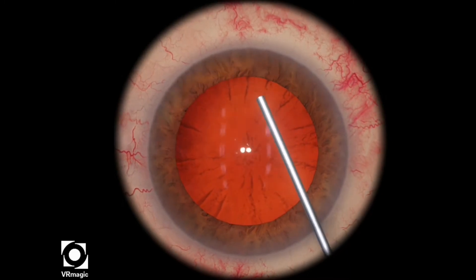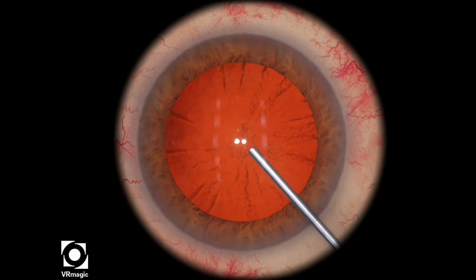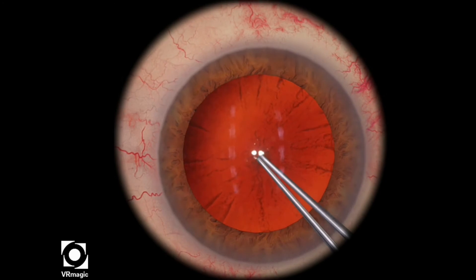In this particular level, it is the same as the high tension level, except you don't have the black circle to guide you on how big your rhexis is. So try to use your imagination and imagine where the black circle is.